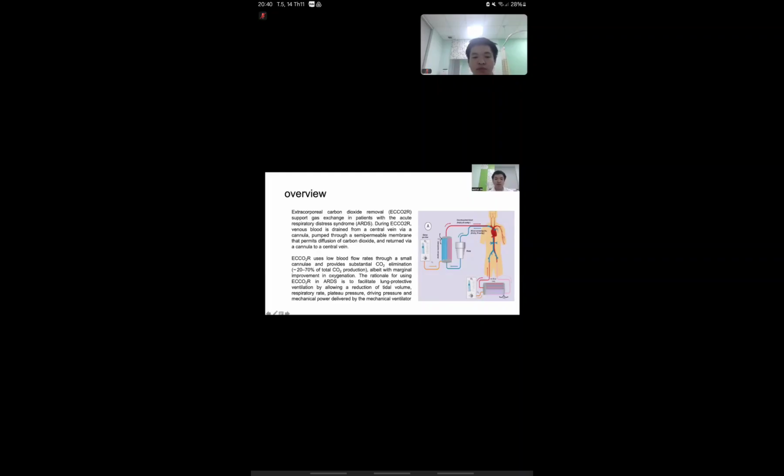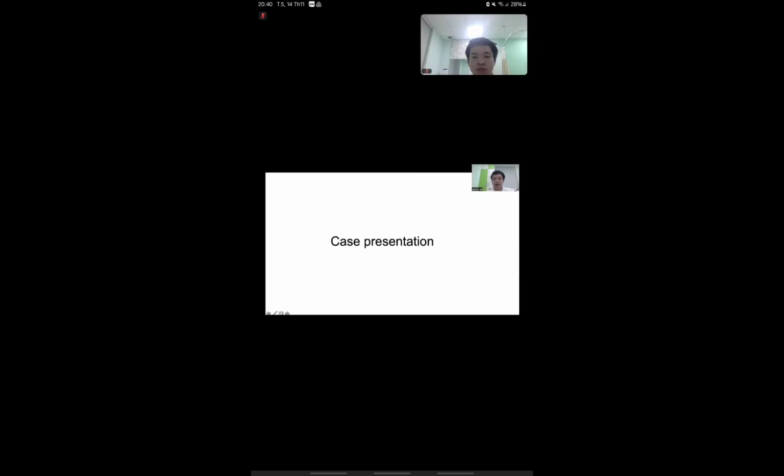The rationale for using ECCO2R in ARDS is to facilitate lung protective ventilation by allowing a reduction of VT, respiratory rate, plateau pressure, driving pressure, and mechanical power delivered by the mechanical ventilation. And tonight I will show you a case study.